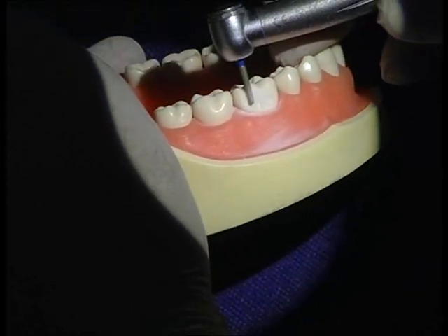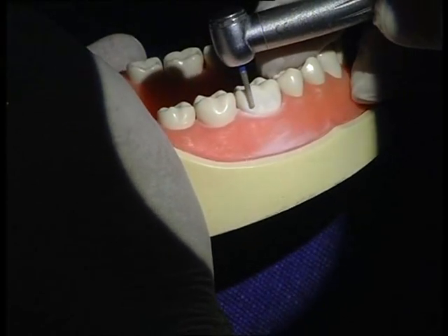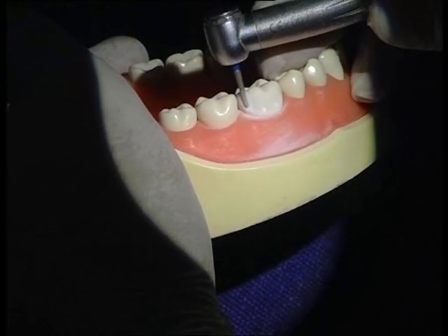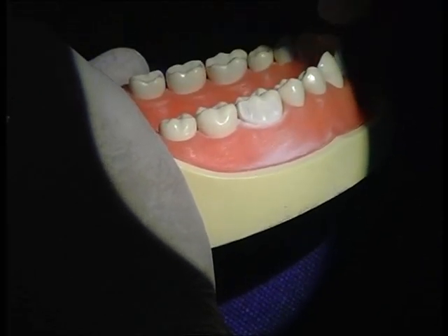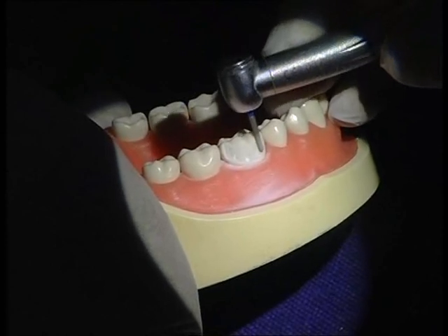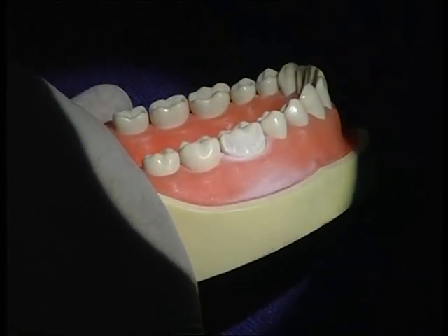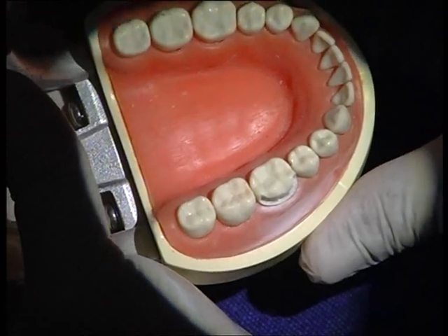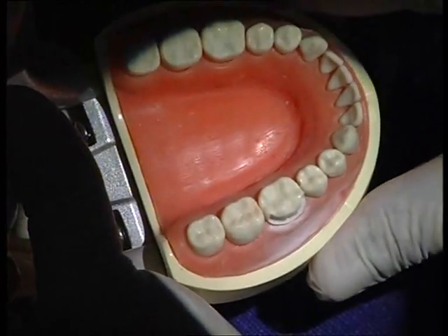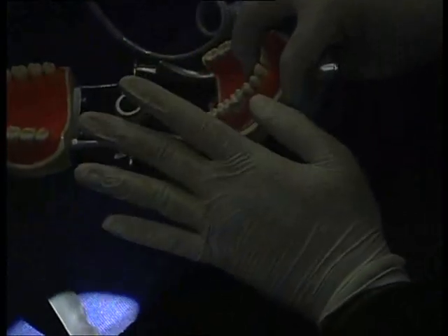Now I will extend slightly interproximally but not break the contact. Pay careful attention — I've gone interproximally but I haven't broken the contact. Same thing I will do on the other side. So this is where I tentatively finish my margin. Can you appreciate a good, definite buccal finish line? It will have a few grooves but that's fine, because I still have to use my finishing burr.